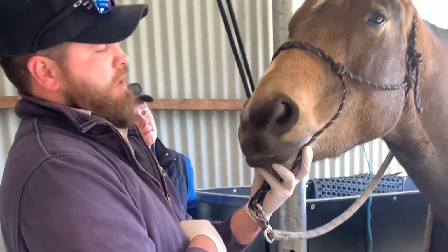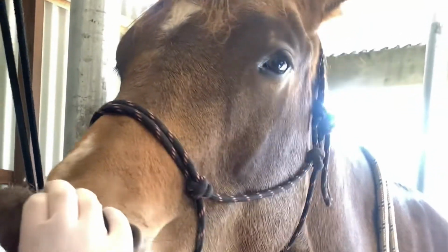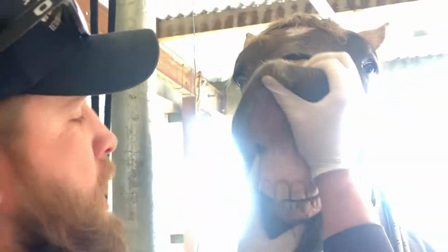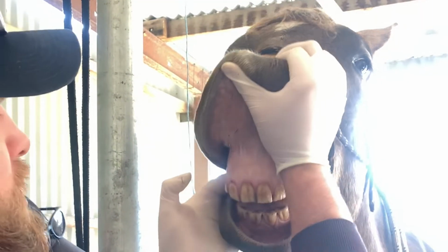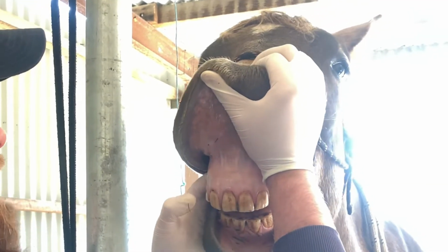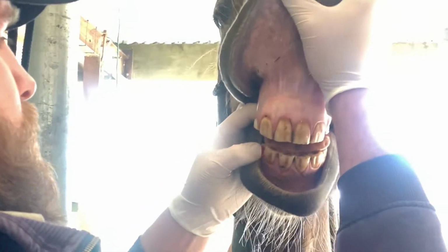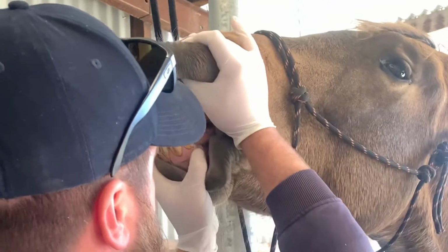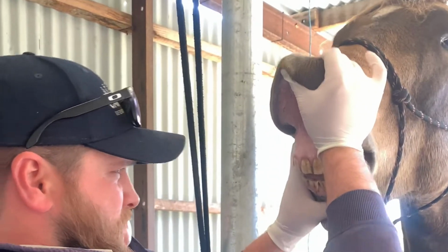Next step, we want to have a look at the incisors. So nice and sedated, we're going to lift up our lip and examine the incisors. We can age horses quite accurately on our incisors up to about 5 years of age. In this particular horse, as these teeth erupt, 2.5, 3.5, 4.5 are in wear by 3, 4, 5. So this tooth hasn't erupted, but it is starting to erupt. So we know that he is 4.5, heading towards 5. That tooth has erupted, that tooth hasn't, so he's in the middle of that 4.5 age mark.